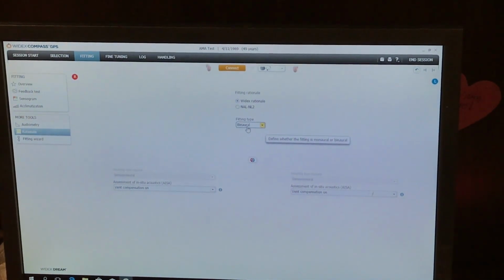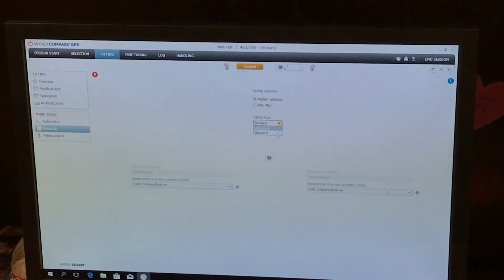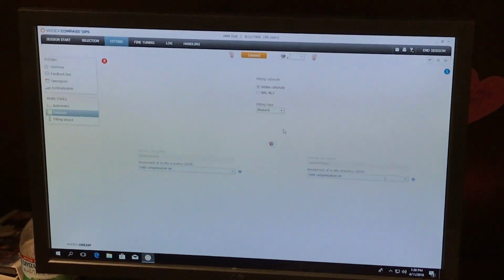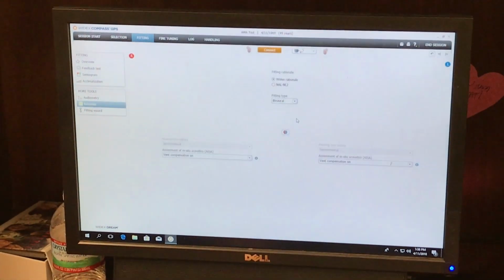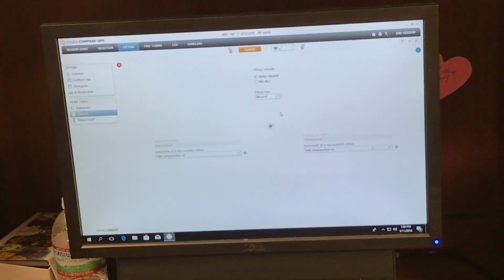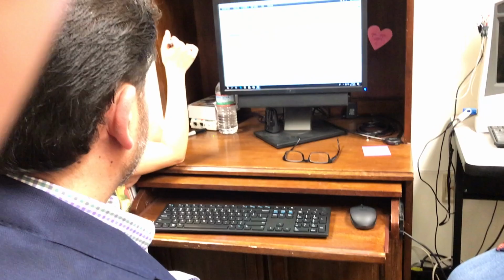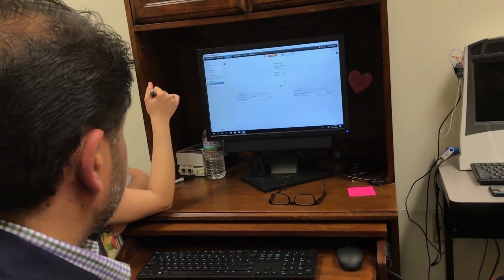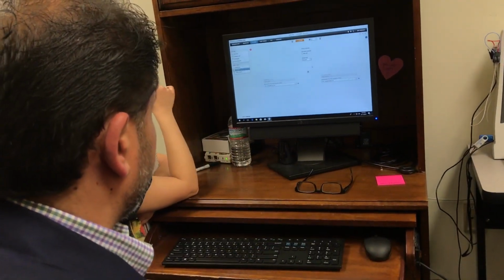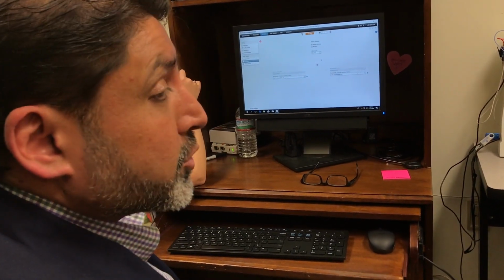See this thing? I've got this thing that says monaural or binaural. Why do I have that in there? From one hearing aid versus two. And why is that important? As it relates to gain. Well, because the two hearing aids communicate with one another, right? These are independent devices. They don't talk to each other. Localization. Nope. You're close.